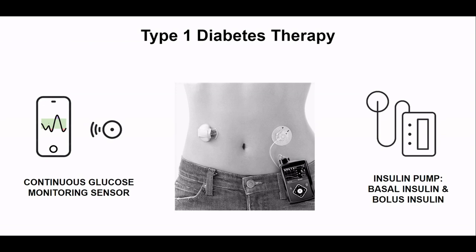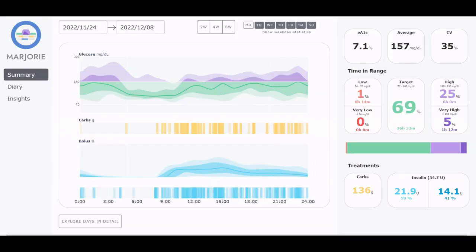Marjorie helps patients and their doctors to retrospectively analyze their data to find patterns and to optimize the therapy parameters. We demonstrate the usability of this tool through a case study now. The menu on the left side opens three views: summary, diary, and insights.